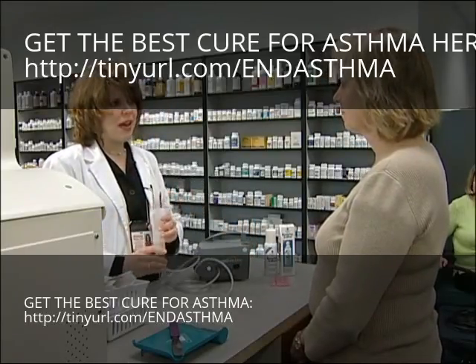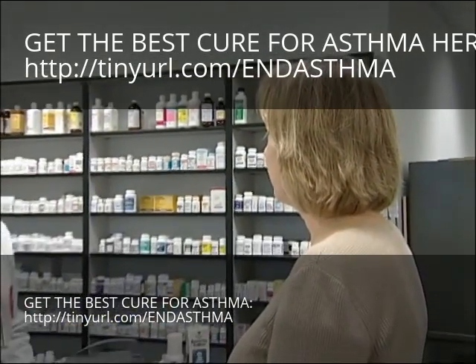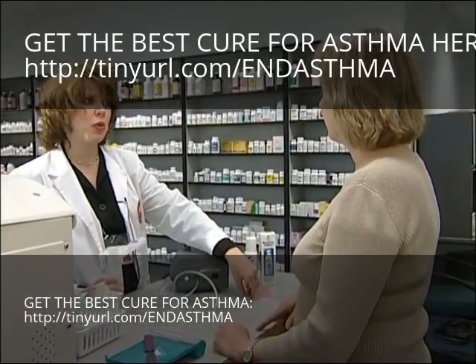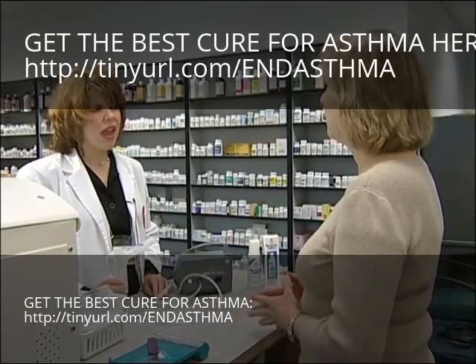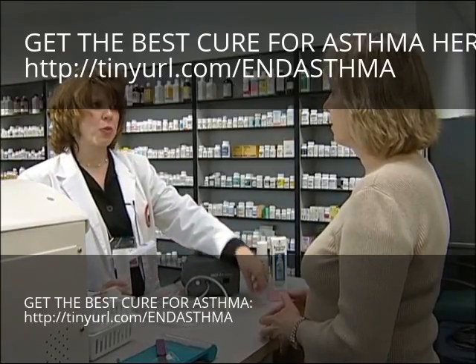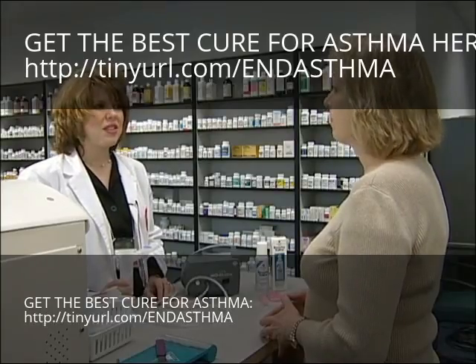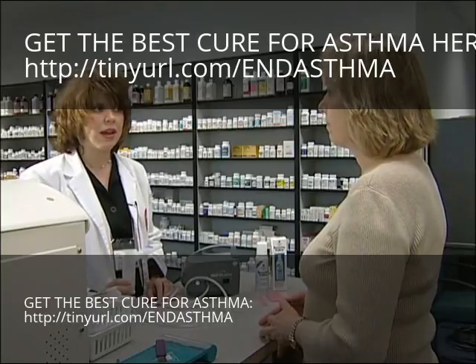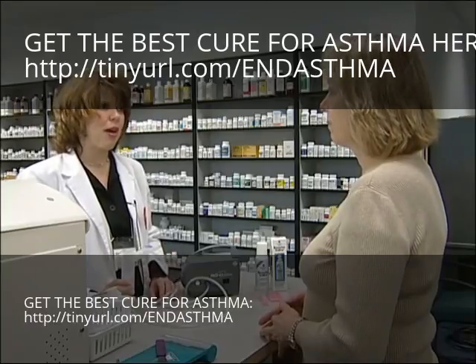Do you have any questions about how to use your nebulizer? How long does it take for one treatment? It takes about 10 to 15 minutes to use one nebule of medication and finish one treatment. And how many days do you have to take the medicine? It really depends on which medication your doctor has prescribed. For the medication prescribed today, which is albuterol, you use it when you're having trouble breathing — as frequently as needed. It will differ from day to day, but it's very important to follow your doctor's instructions exactly as prescribed.